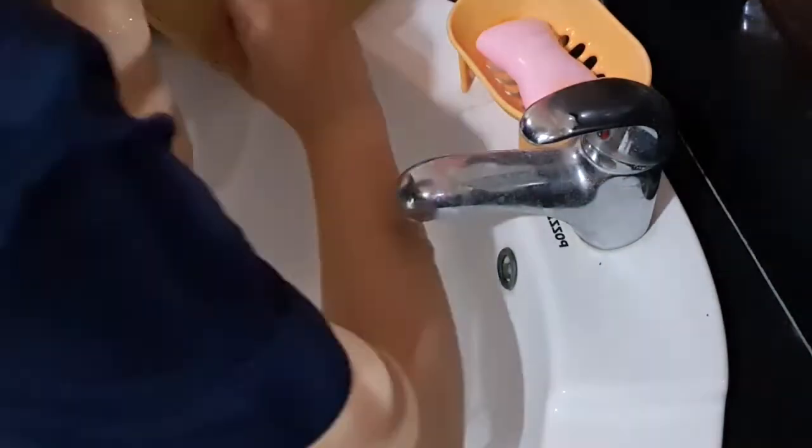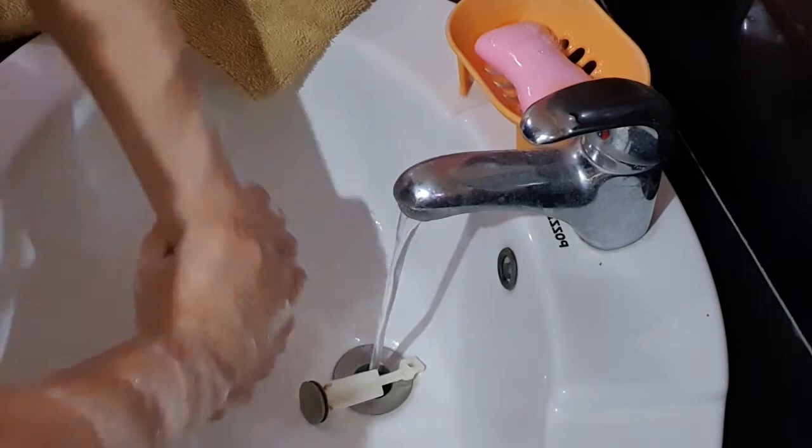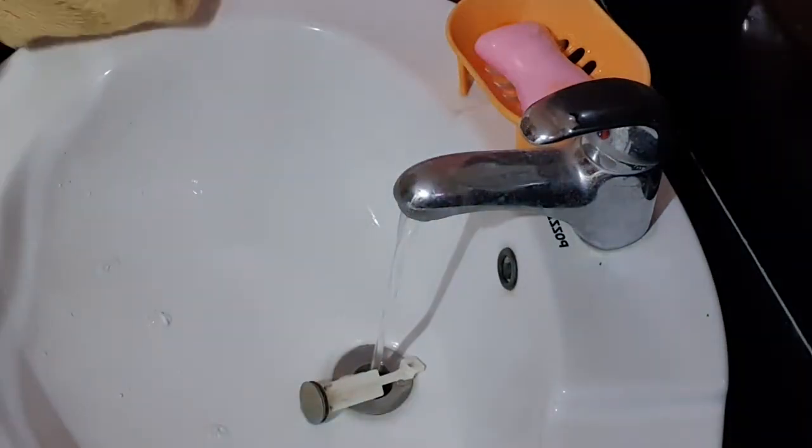For the follow-up phase, I will now perform hand hygiene and assist my patient to a comfortable position. So this reduces the spread of microorganisms and promotes patient comfort.